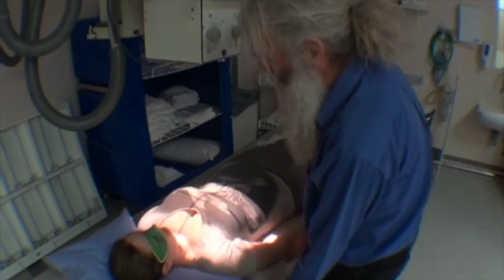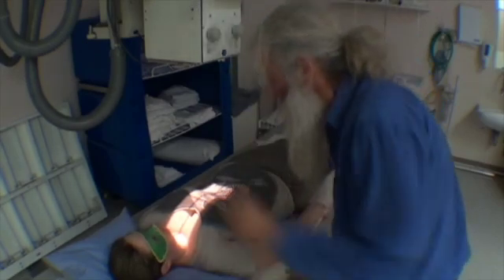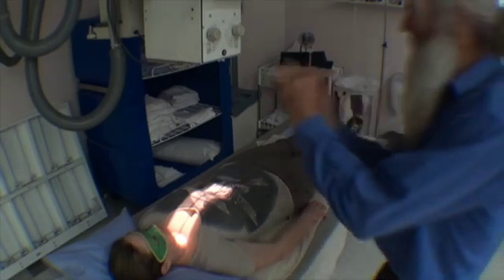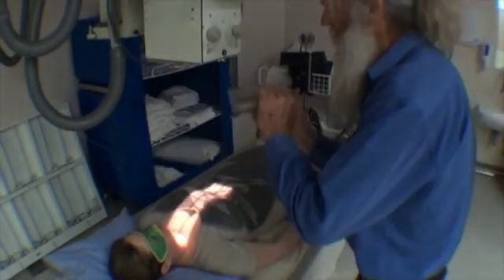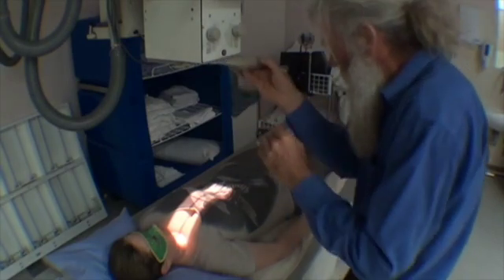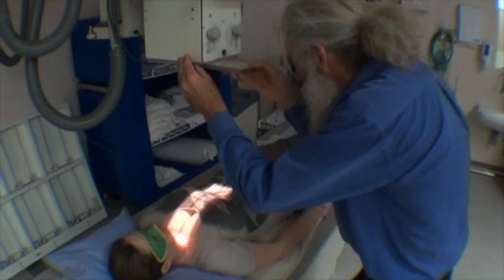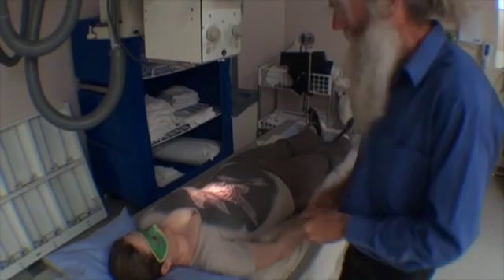There are no centering points — if you get the top on, the rest of it will be on as well. So that's all good there. And again, I'm going to use my wedge filter — just a piece of aluminium in a wedge shape — to even up the densities, by just sliding that into position just like that. And that would be my first exposure there.